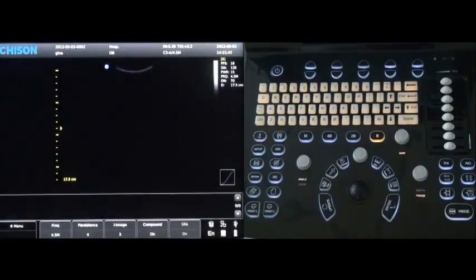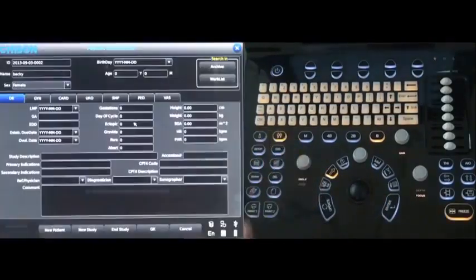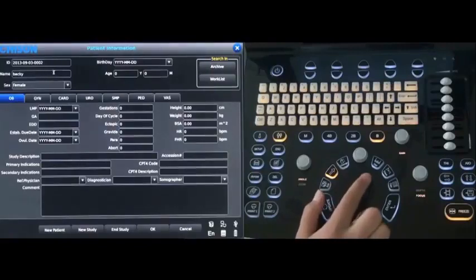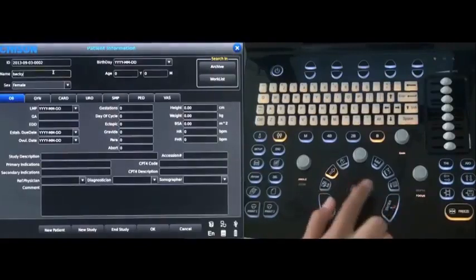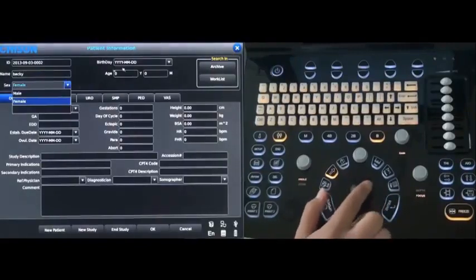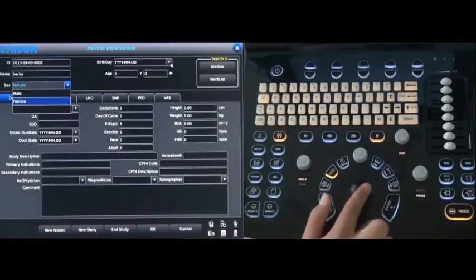Create the new patient information. Press the patient key. Enter the patient name, sex, and also the birthday. Then press OK.